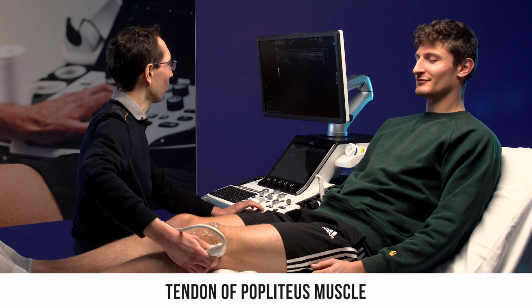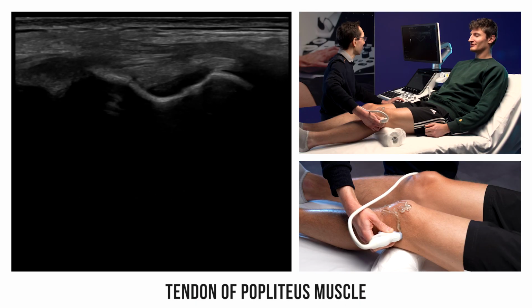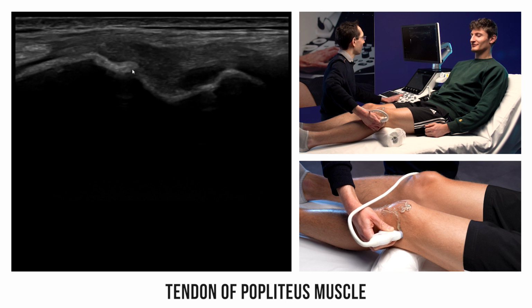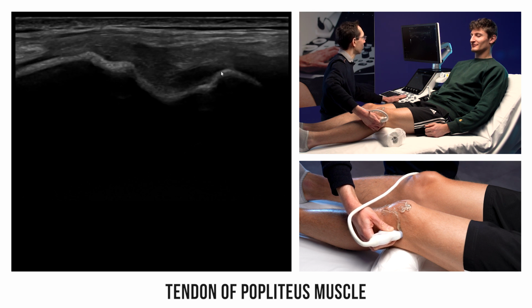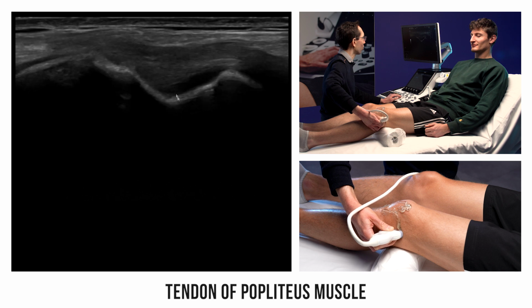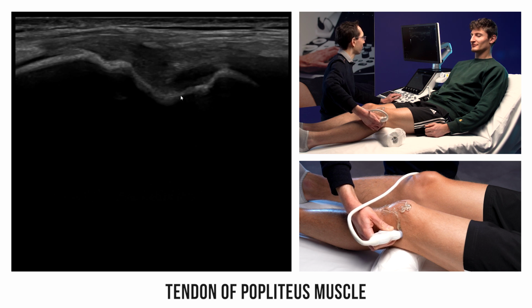The tendon of the popliteus muscle will be analyzed on a coronal view at the level of the lateral femoral epicondyle, where it originates in a small bony fossa, which is easy to locate. The main pathological finding here would be the presence of tendinopathy or enthesopathy.